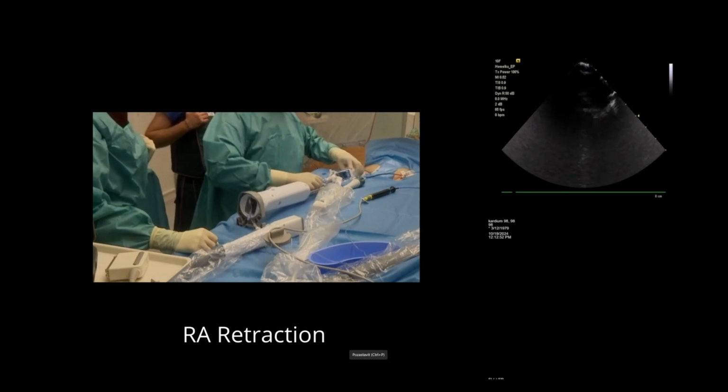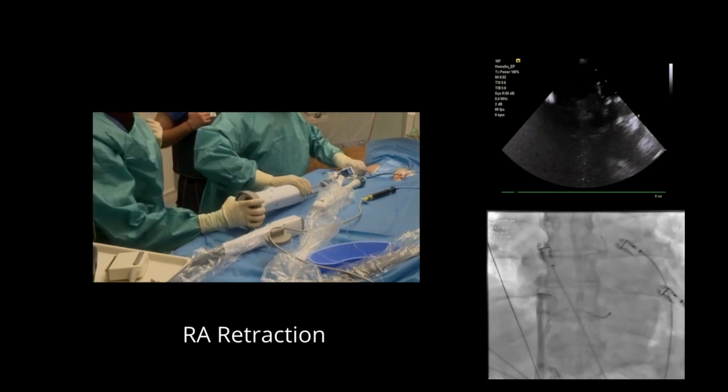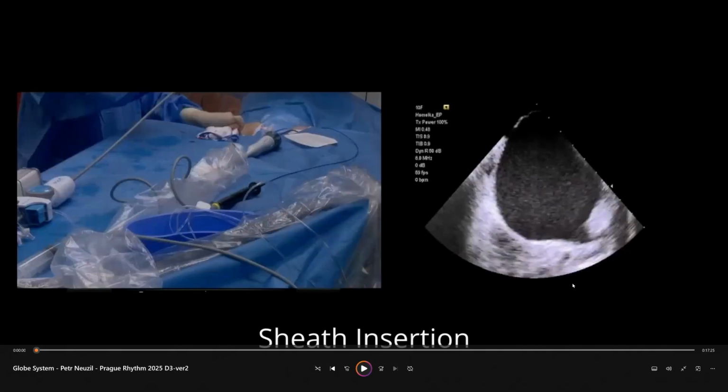It's very important, even on the right side, to take it out safely. And now we are back and we finish the case. So guys, I'm finished with this. If you have any questions, I am more than happy to answer.